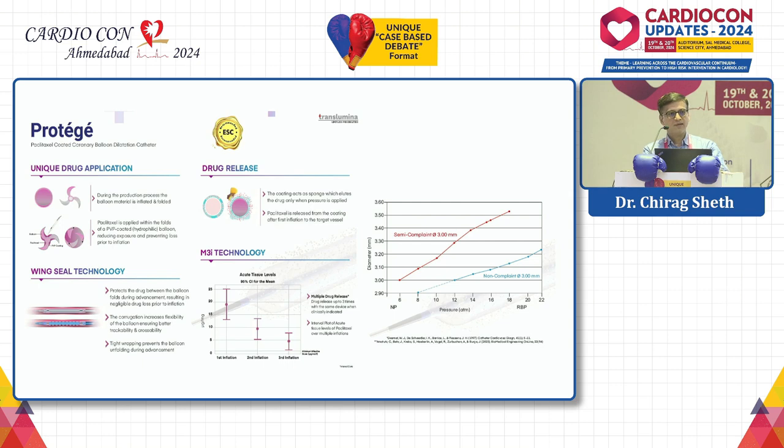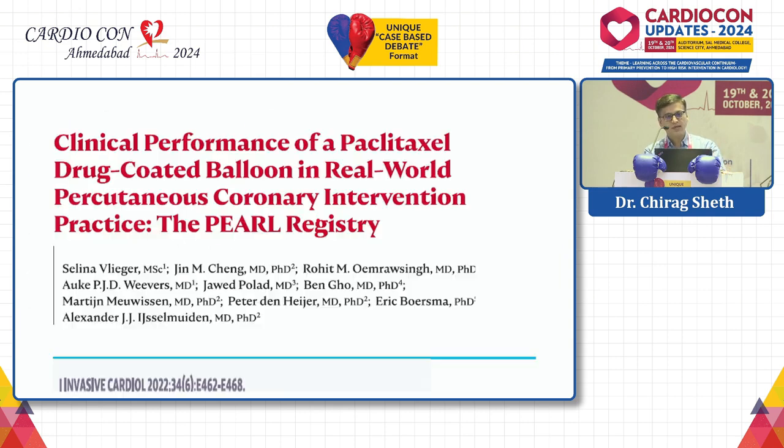And because of minimal loss of drug during transit, almost maximum tissue delivery is possible at the site of application of drug, and therefore your inflation time is also likely to be small. Rather than 60 seconds, it is 30 seconds alone. And again, you can have multiple inflations to deliver the drug locally if required clinically.